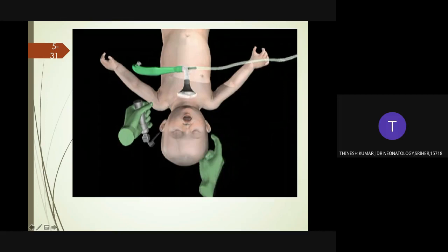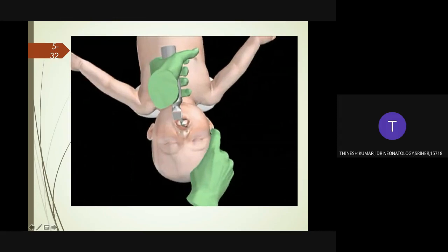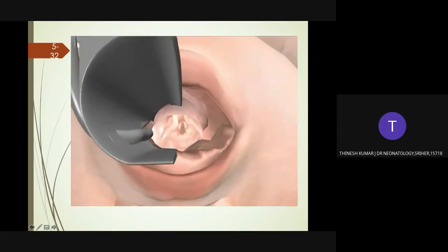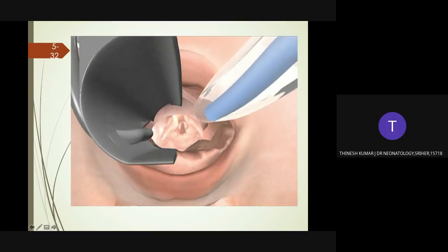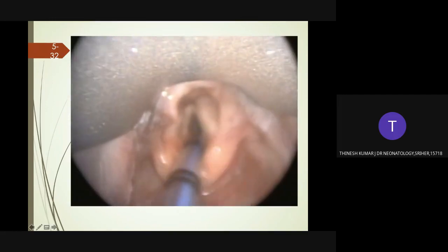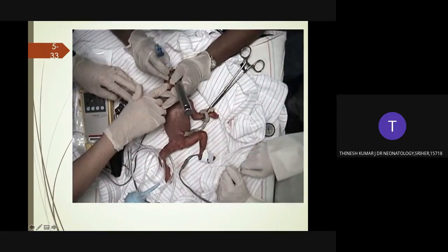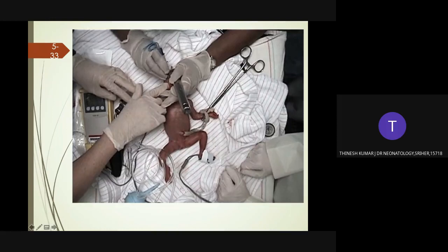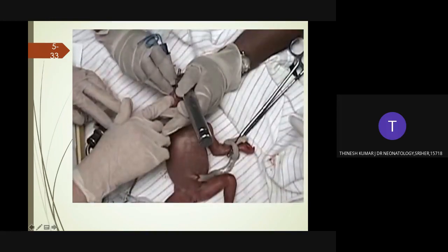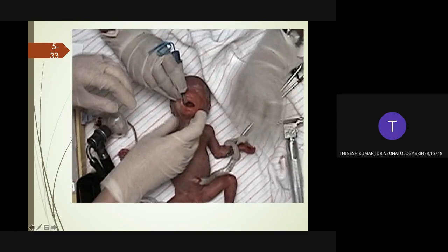Stabilize the baby's head with your right hand; free-flow oxygen should be delivered throughout the procedure. Introduce the tube into the right side of the baby's mouth with the curve of the tube in the horizontal plane — this prevents the tube from blocking your view of the glottis. Keep the glottis in view and when the vocal cords are apart, insert the tip of the endotracheal tube until the vocal cord guide is at the level of the cords. Stabilize the tube with one hand and remove the laryngoscope with the other, holding the tube firmly at the lips against the baby's hard palate.